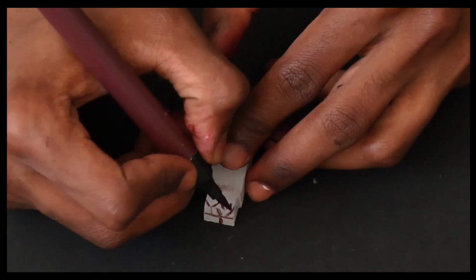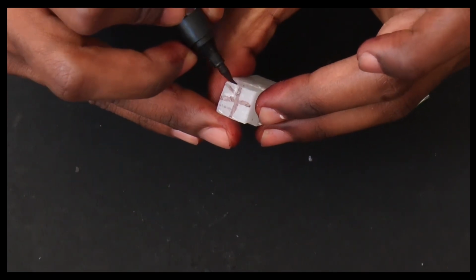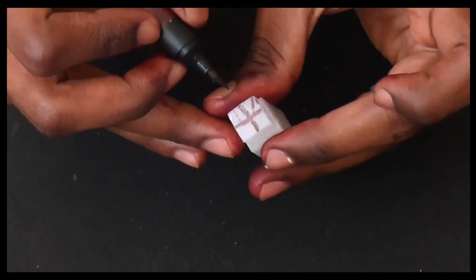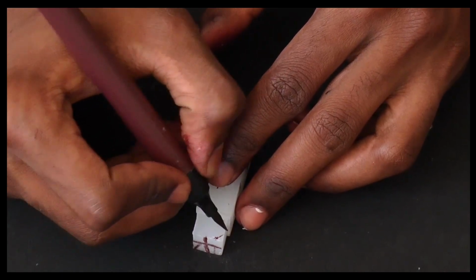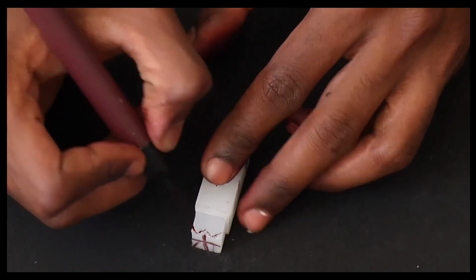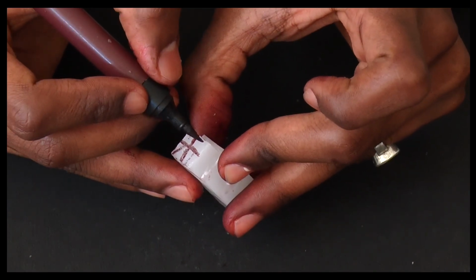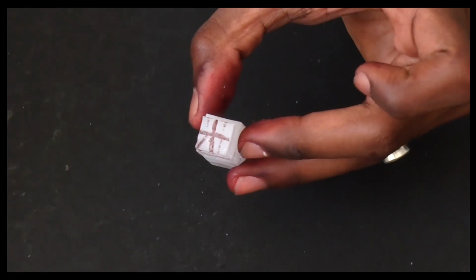This is a very small triangle. The distal cusp has a very small triangle because this is coming sidewise. Whereas the lingual aspect has 2 nice triangles, both of them like this, and here are the cuspal ridges.